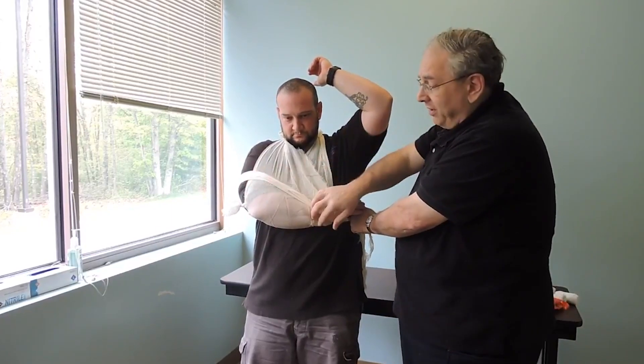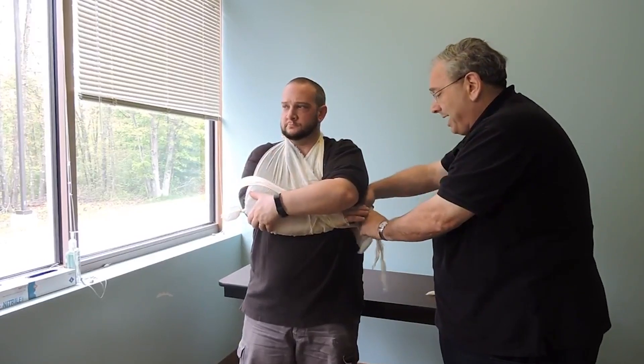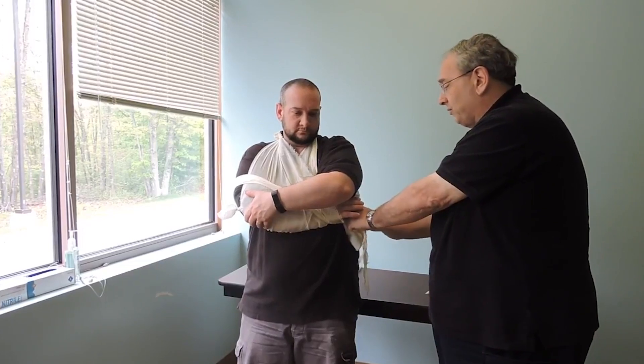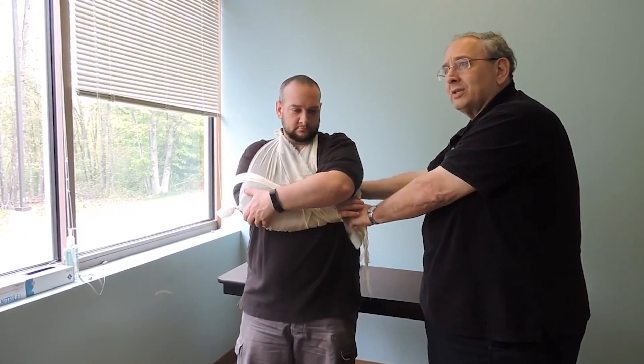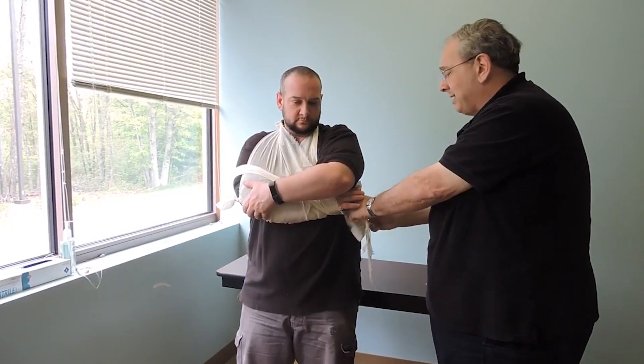It immobilizes the upper half and the lower half. I'm going to take a piece of padding and pad the knot. When I do this, I specifically want to tie this knot against the ribs — if I tie it back here, I've got soft subcutaneous tissue that doesn't allow me to get it tight enough.